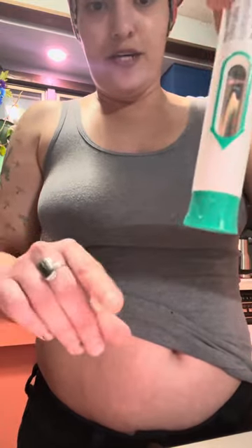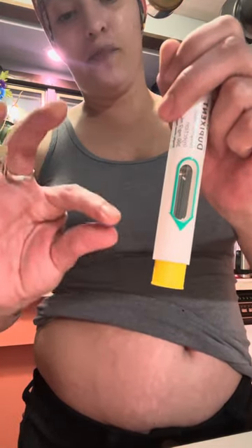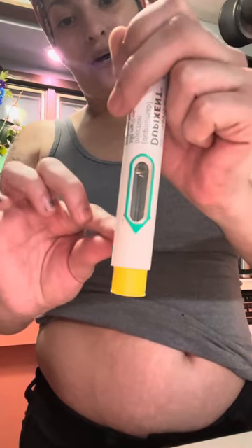I like these pens because you don't see the size of the needle — on the self-syringes you do. You take the cap off and you have to hold the pen in place for the whole clicking period. It'll make a clicking sound at first, then you have to wait until it makes that second clicking sound and you see the vial is all the way empty.